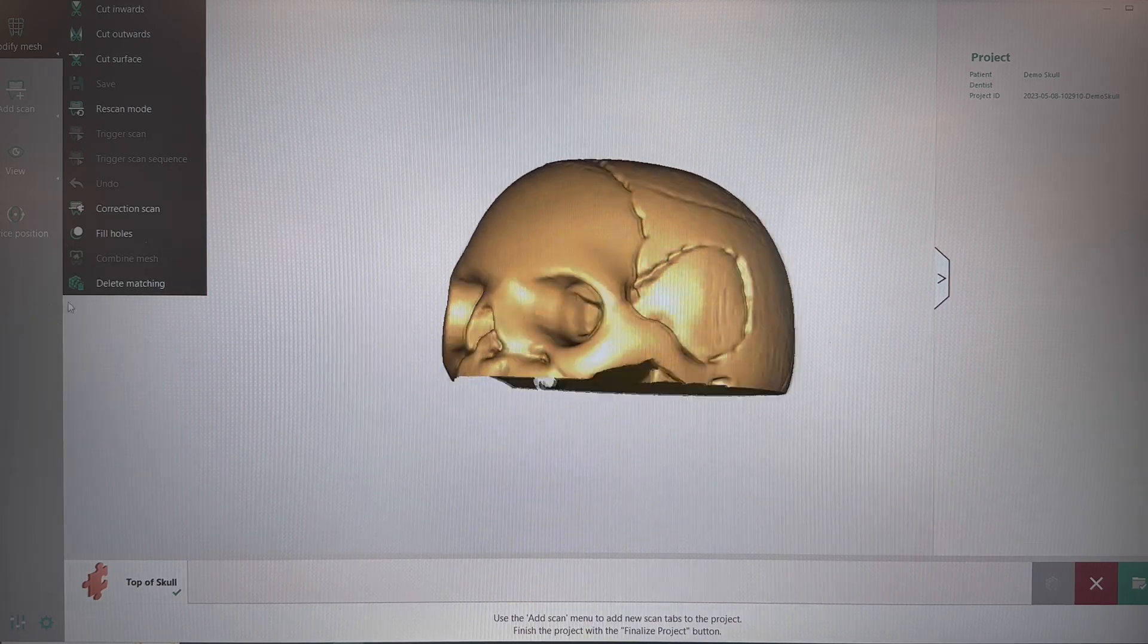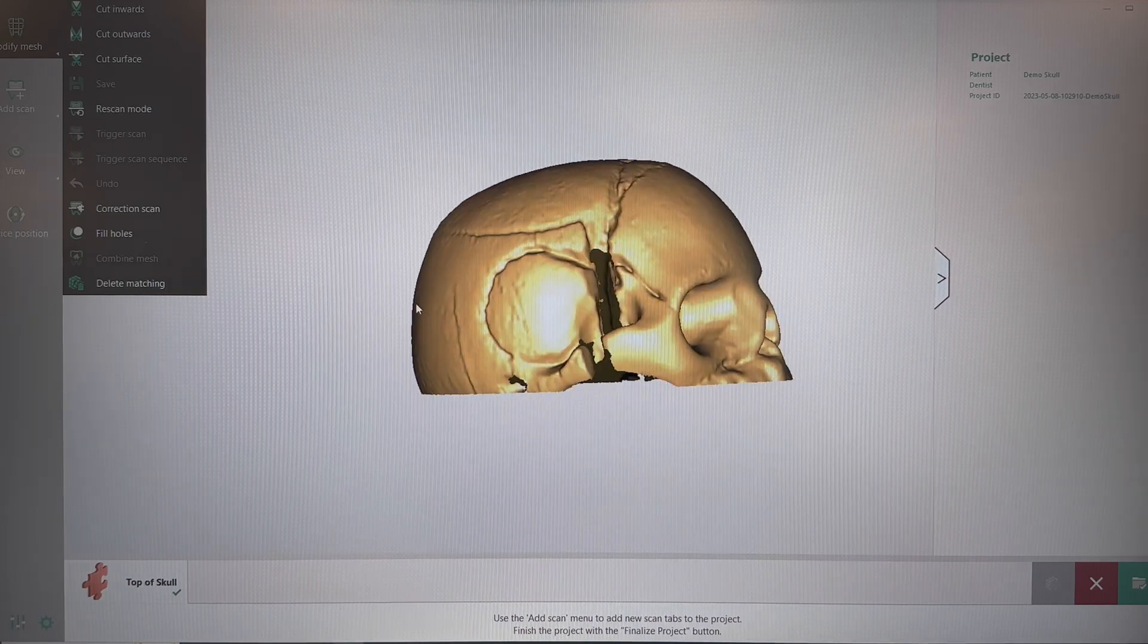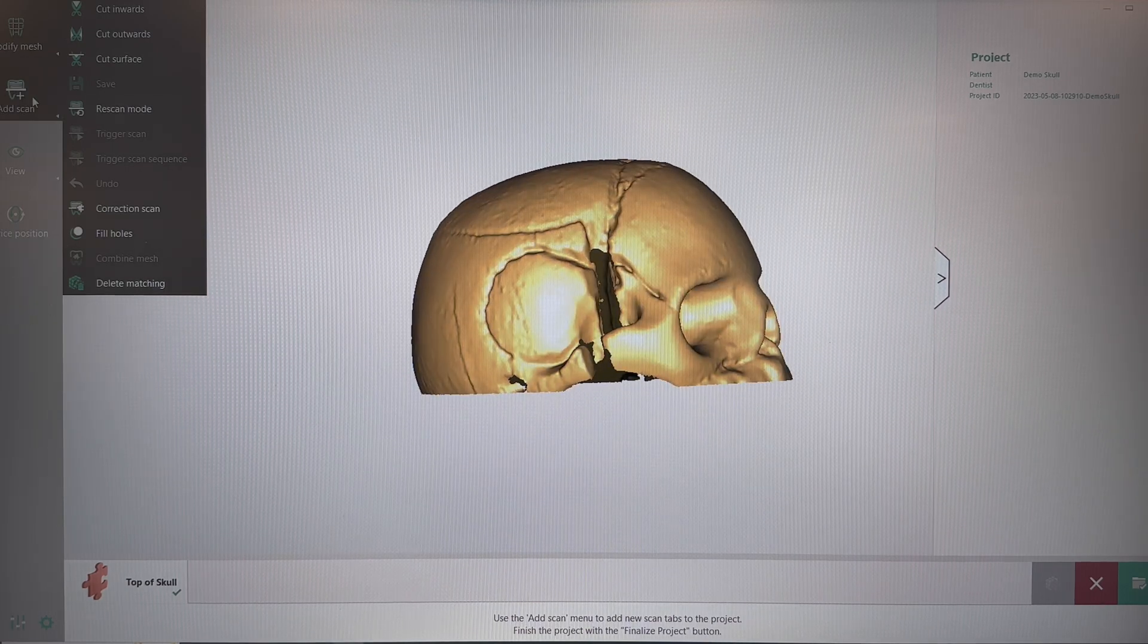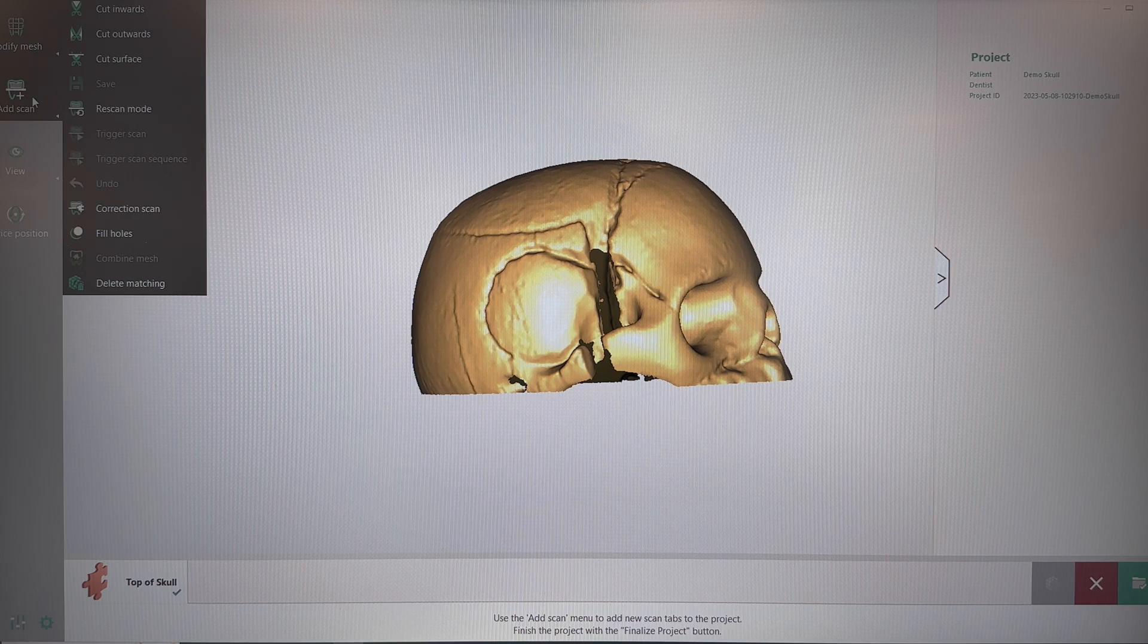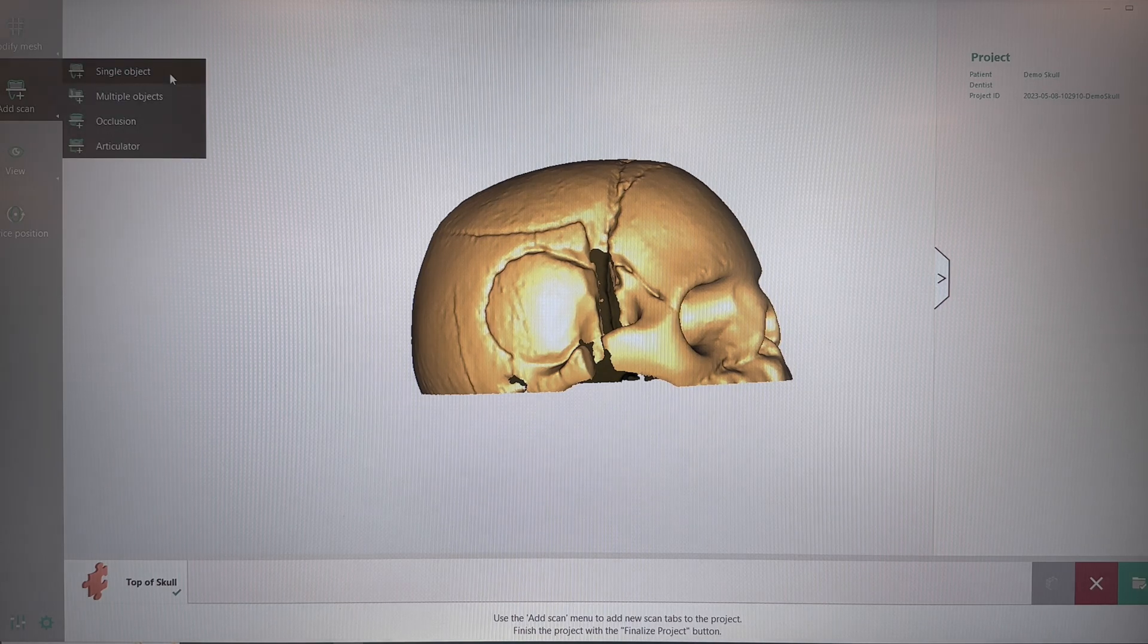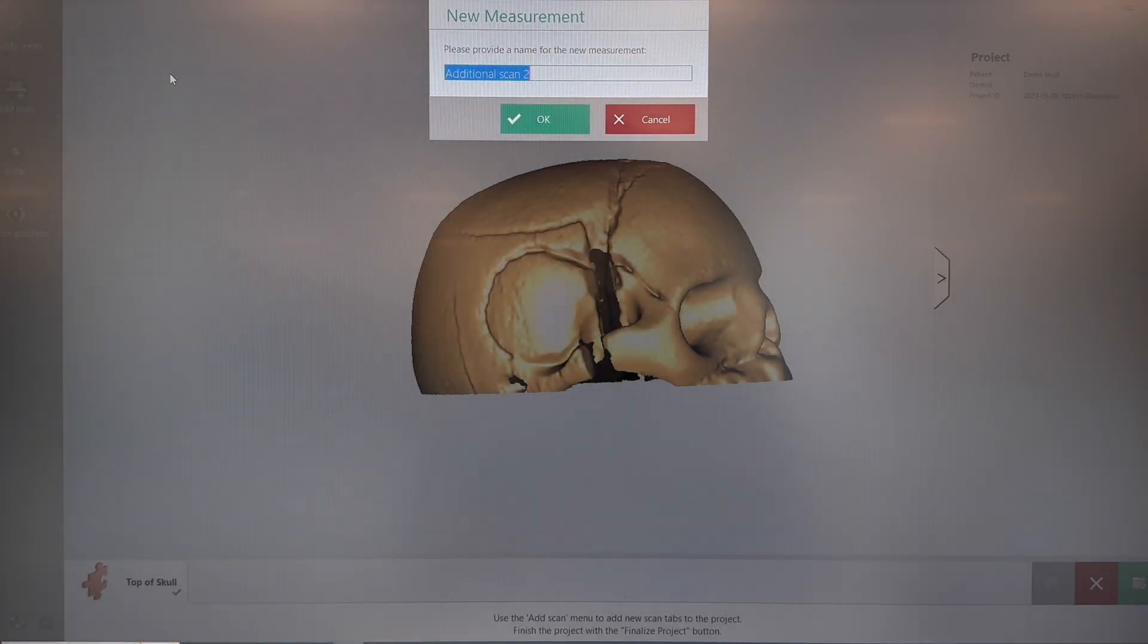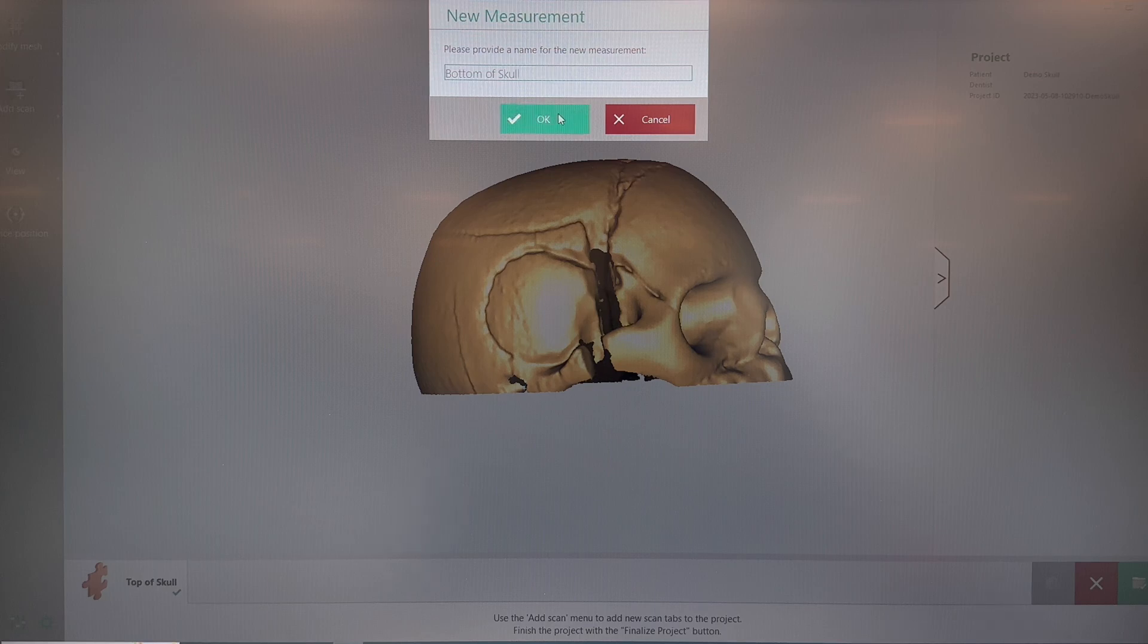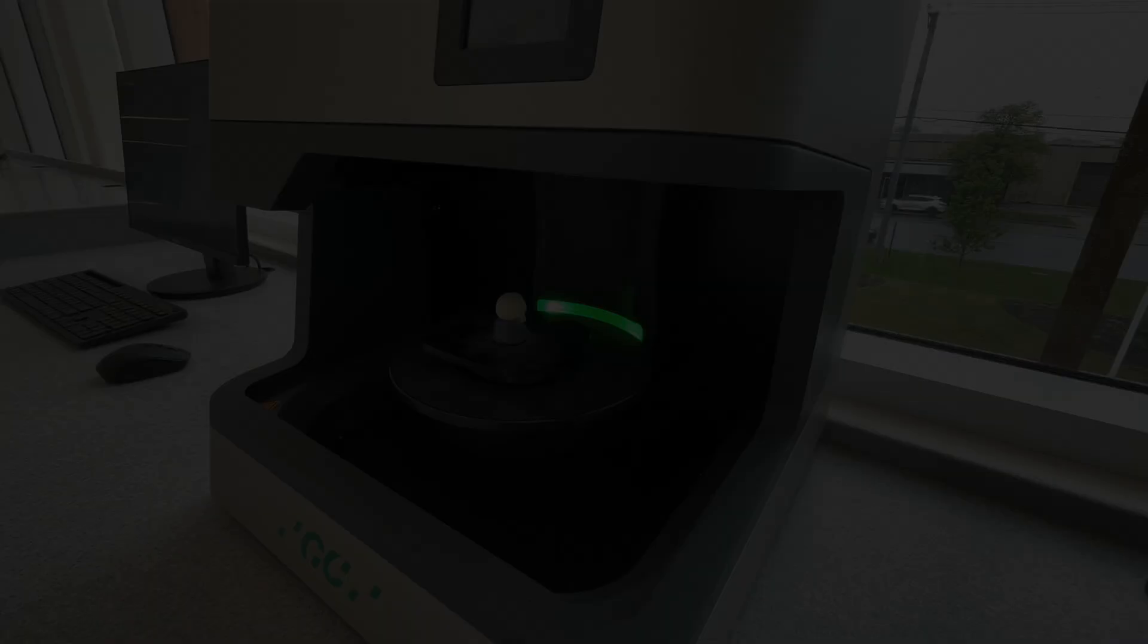Now we need to add the bottom. To do this, go to Add Scan on the left, choose Single Object, rename this one, and click the OK button.